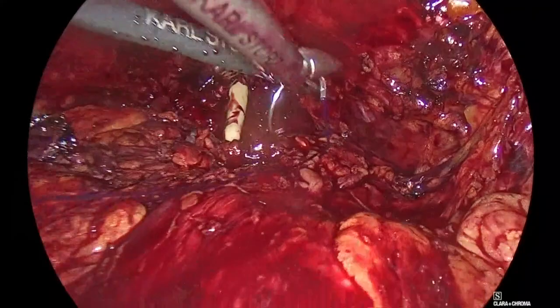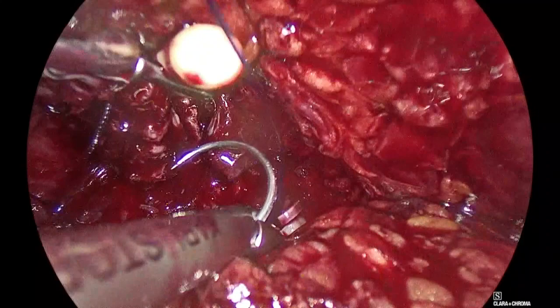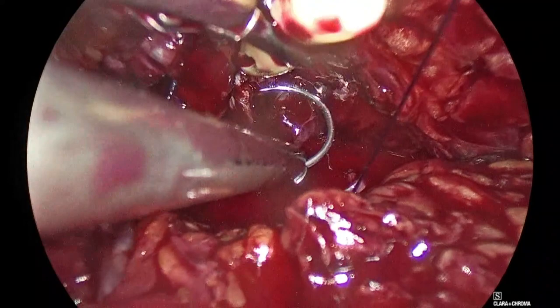Good. Stop. Rotate it, Padeli. Rotate the other side. No, the other side. Yes, stop. Tampon, please. Come in, Padeli. Going down. No. We will need the help of a tampon to push here for the posterior layer.